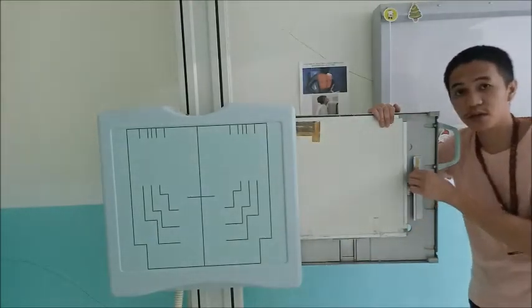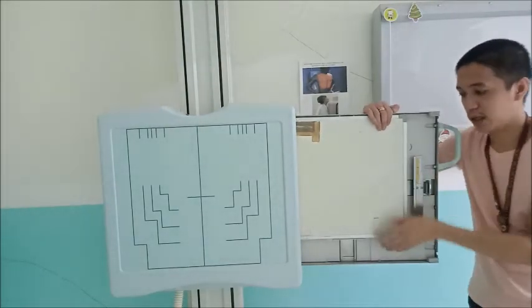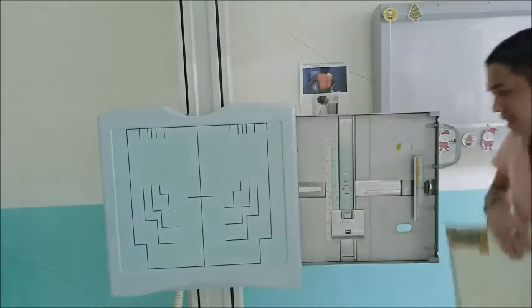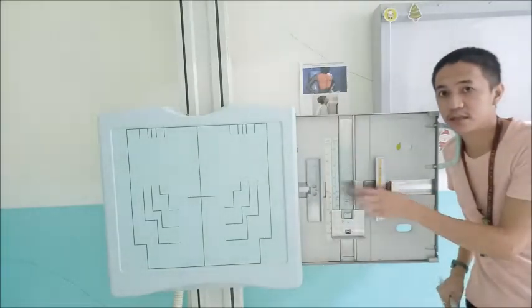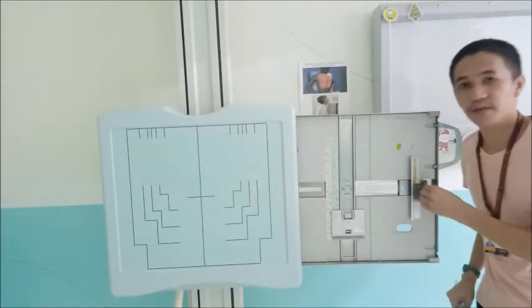And then you have also the metal plates. There are the lateral portions, again the green one, and its pair on the other side. Okay. So there are two of them in order for it to clip on to the film.